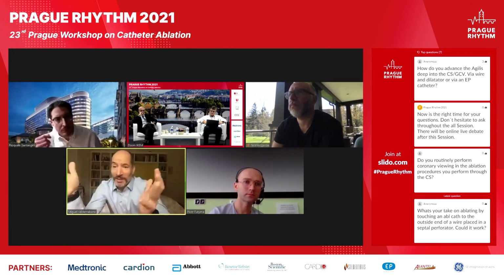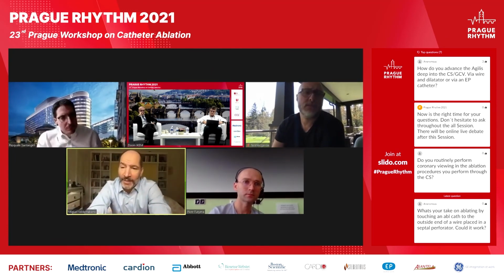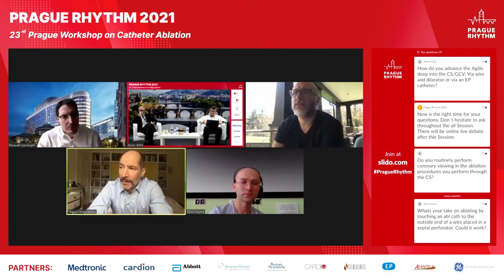Now you want to stop at some point. Obviously, you want to limit the lesions. But clearly for a given spot, I've been giving a minimum of 4 cc's.